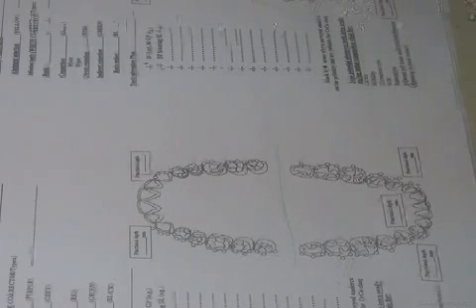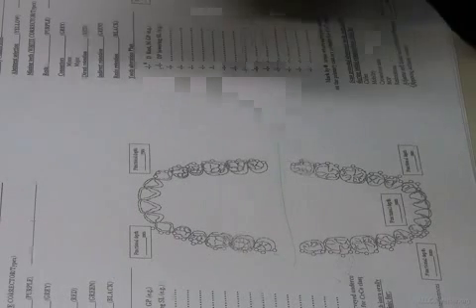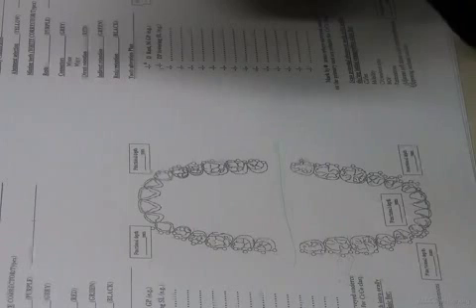What is its relation to the survey line? It's below the survey line, right? It's in the undercut. Which undercut? The one suitable for the clasp. Because every clasp design or clasp material has its own, and this came up in your exam. Every clasp type has a different, specific measurement for it. Okay? So the first thing is its relation to the survey line occlusally.